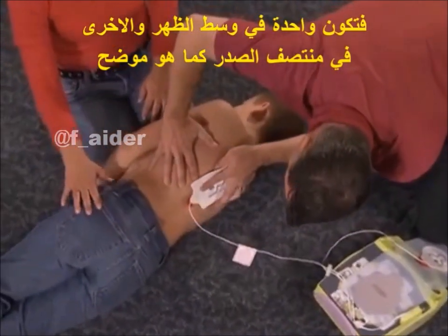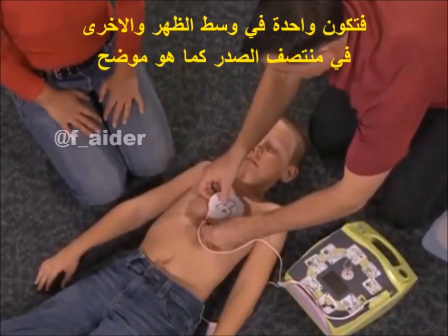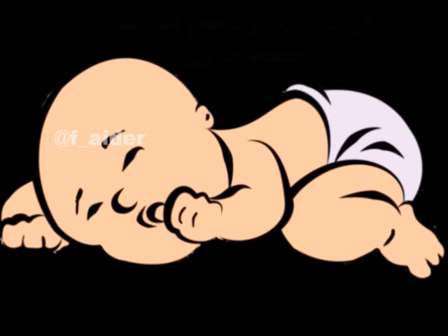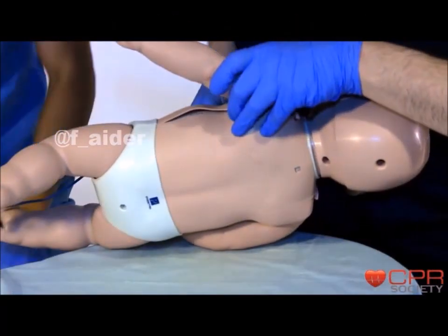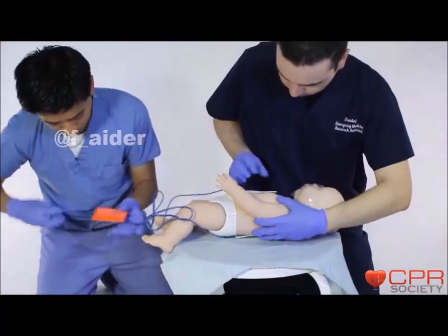With children, typically one pad goes here, and a second pad typically goes here. Attach pads to the person's chest as shown.